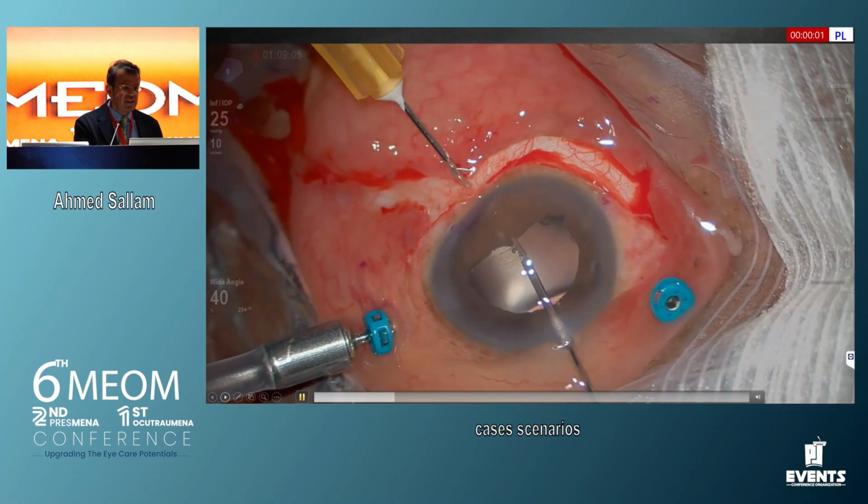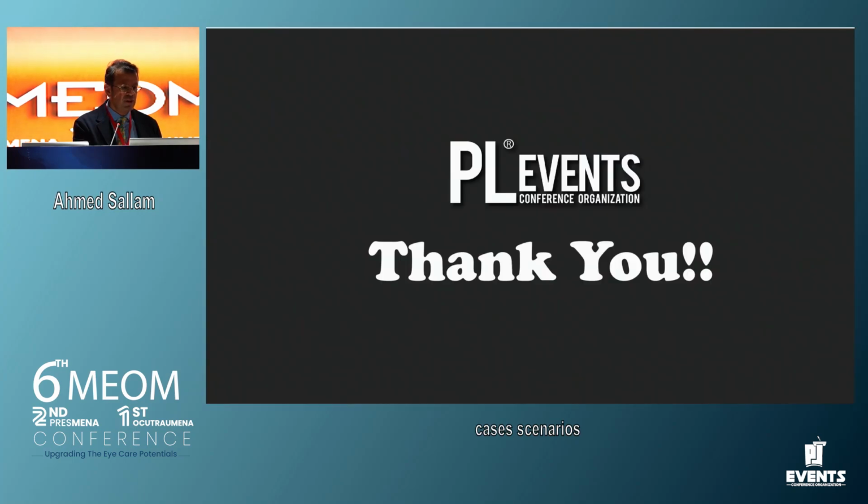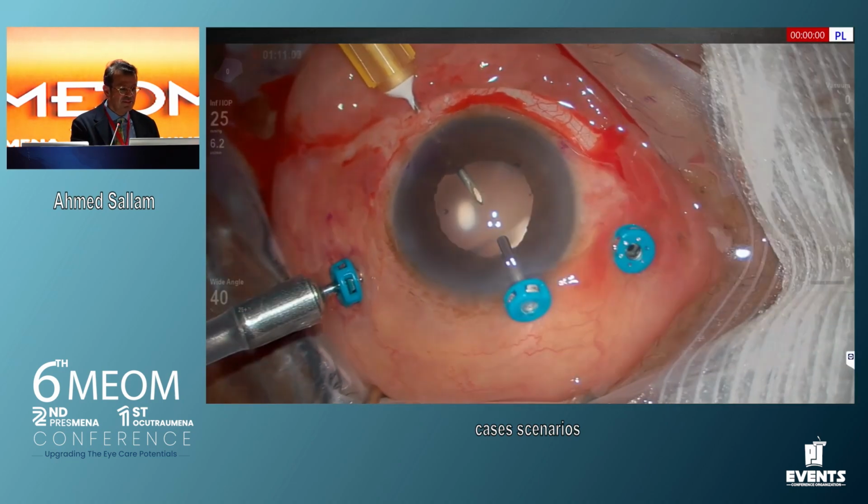And here it's easier. You can do it from the other way. Again, the patient is phakic, so it's easier. So you can go from the other way. You can give him Yeah. 1 minute. Yeah, 30 seconds.